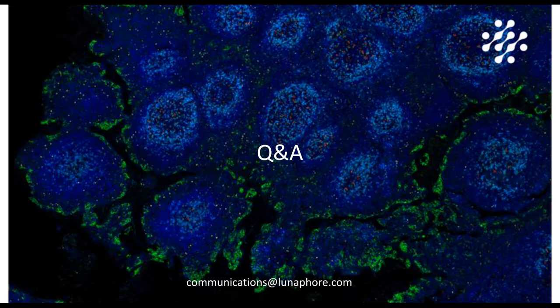And so TSA is known for such challenges, so it's very important to make sure that you do not mask the detection of your markers with the detection of previously stained markers. So of course there is a comparison of signal to background ratio to make between the single marker stainings and the multi-marker stainings.